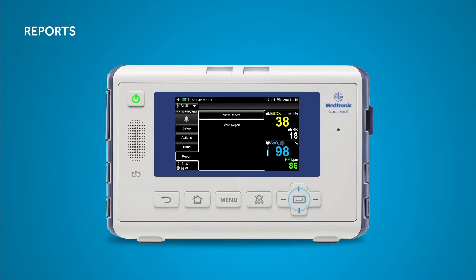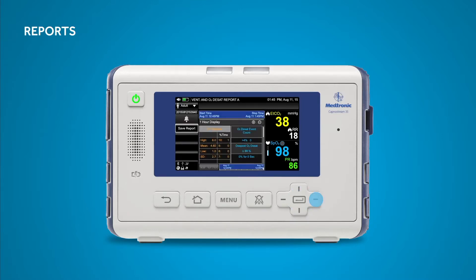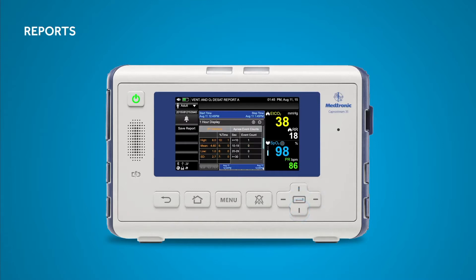Select the report you want to view and press Enter. To scroll down a report, navigate to the main window, press Enter and use the up and down arrows to scroll.